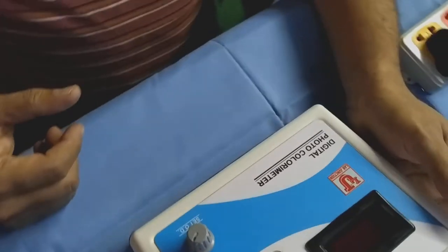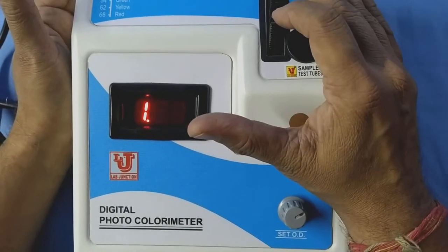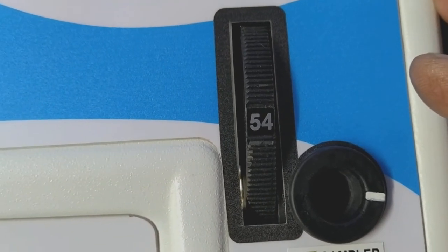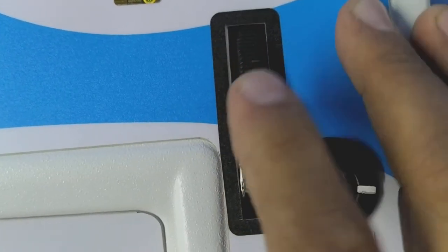Now, switch on the instrument, set your wavelength of your test. Suppose my test is glucose, which is done on 540. So in this way you set your wavelength from the filter disc like this.